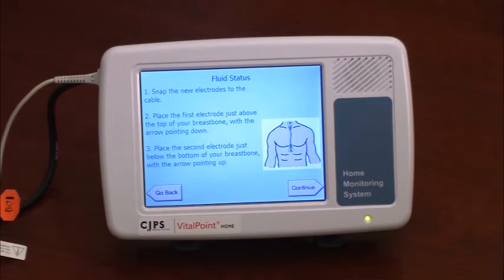The measurement is easily performed non-invasively by placing a device similar to 2 ECG leads on the chest of the patient. One lead is placed below the breastbone and one at the bottom of the neck, as shown on a monitor graphic.